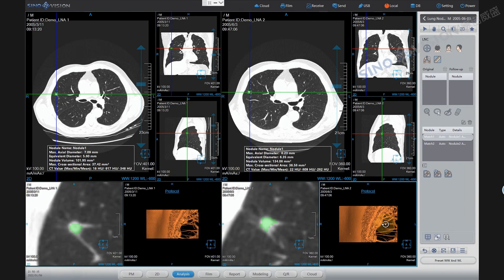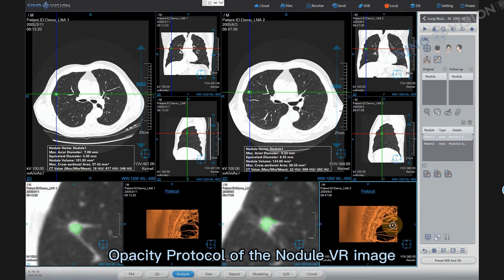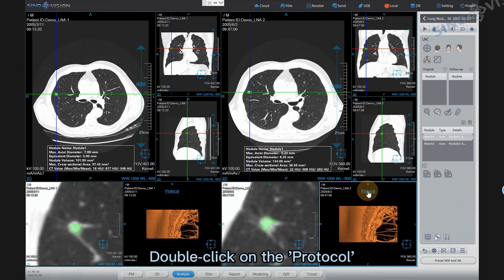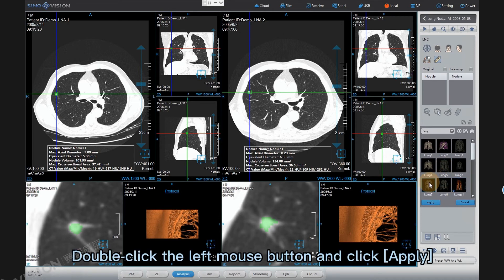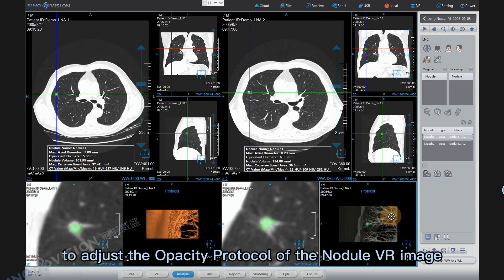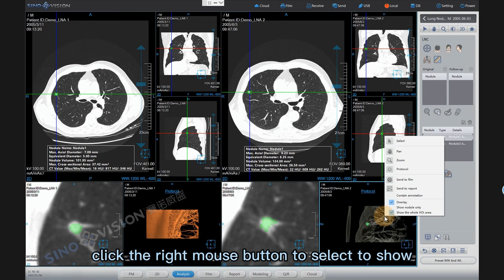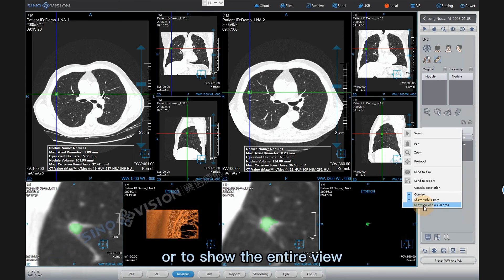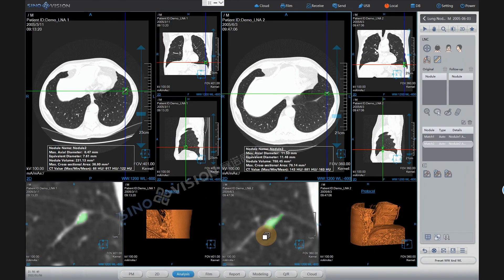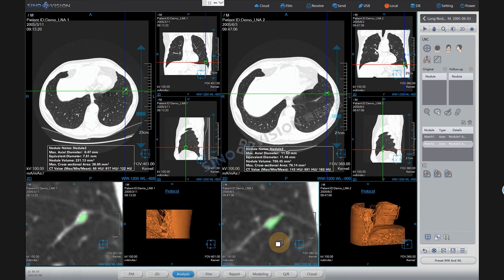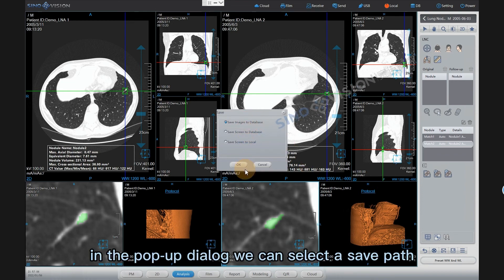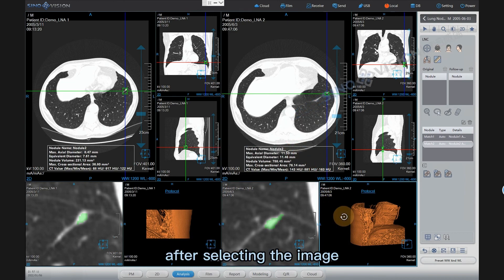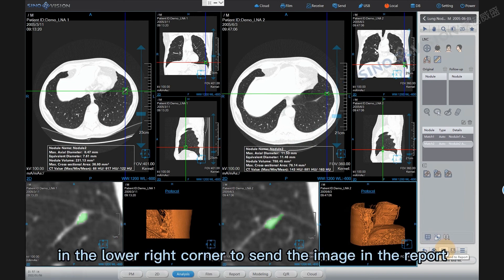After the nodules are matched and compared, we can adjust the opacity protocol of the nodule VR image according to our needs. Double-click on the Protocol to pop up the Opacity Protocol Settings window and select the suitable opacity protocol. Double-click and click Apply to adjust the opacity protocol of the nodule VR image. Click the right mouse button to select to show the nodules only or to show the entire view. If we need to save an image, such as the partially enlarged nodule image, select it and click the Save button in the lower right corner. In the pop-up dialog we can select a save path. To include an image in the report, select the image and click Send to Report in the lower right corner.